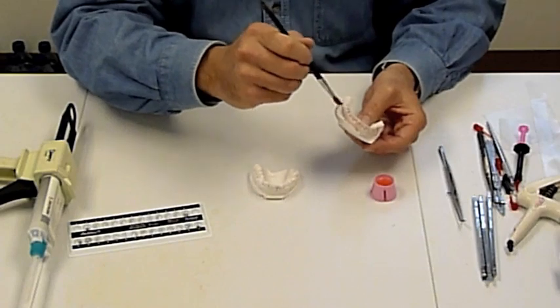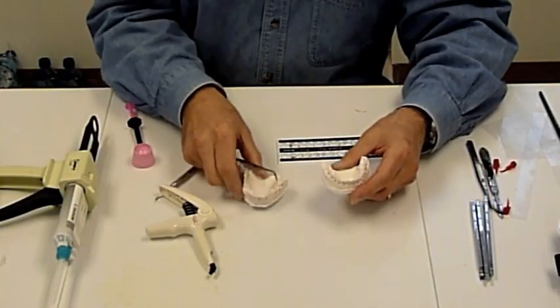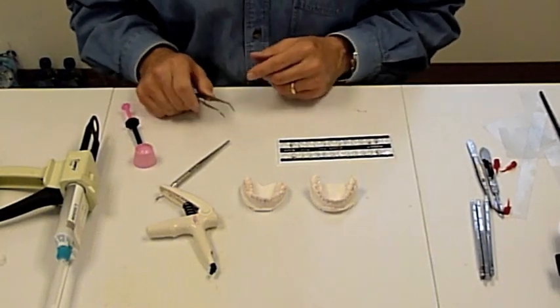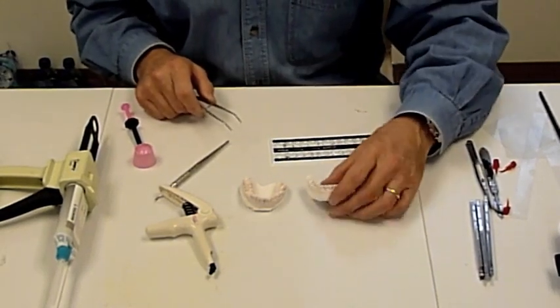We'll coat both the top and the bottom. Once the separating medium has dried, which only takes a few minutes, you can go ahead and place the brackets on the marked models.